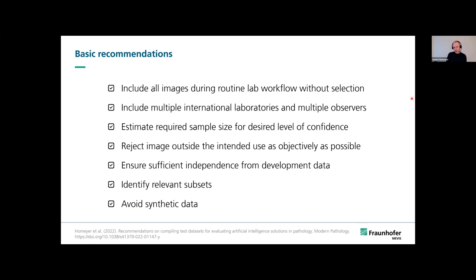what we've often read is a year, for example, just as a general value of orientation. Retrospective data sets should only be used if there's a clear documentation of the acquisition protocol so that potential biases in the data sets can be excluded. Then it is important to include multiple international laboratories and multiple observers.